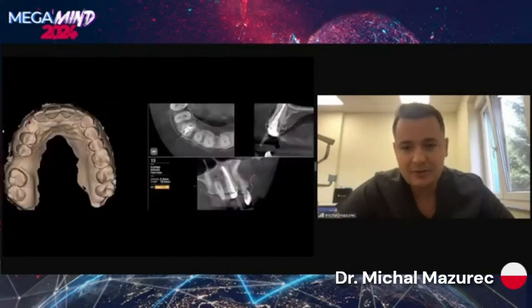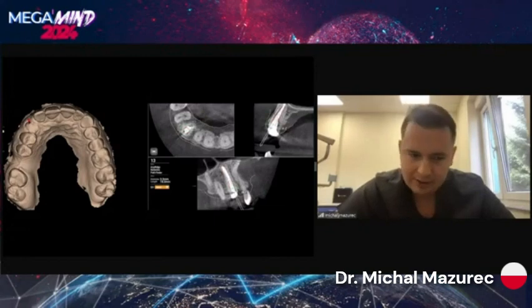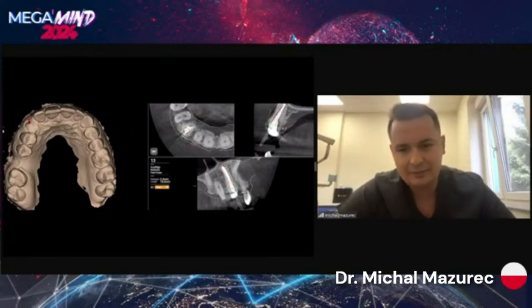And coming to the most interesting part, creating the guide for the partial extraction therapy. In this case, we use an 18 millimeter drill. I mix in this case a guided kit and the Howard Gluckman kit, and now my own kit for the partial extraction therapy. So in the case of this long tooth, I have to remember to hit the apex, to remove all of the gutta percha.